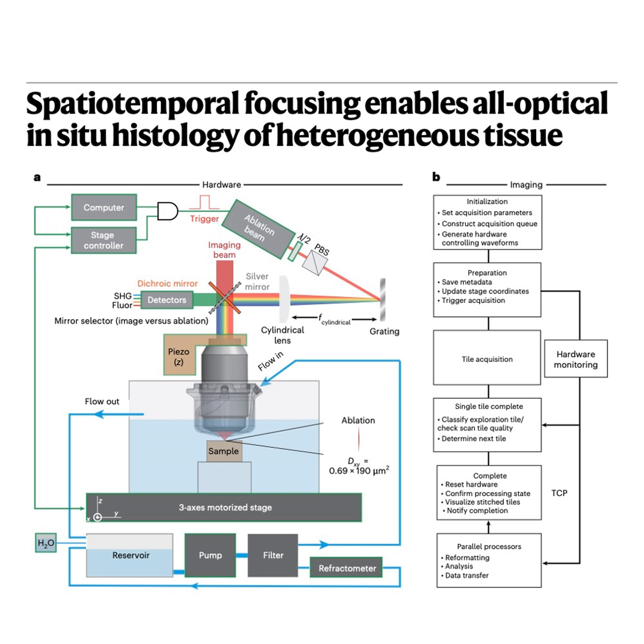Okay, so let's try to synthesize this. We've journeyed through a complex system that leverages some pretty specialized physics, spatiotemporal focusing, to turn a femtosecond laser into an efficient, line-shaped cutting tool. Combined with really sophisticated adaptive autonomous software control, the robot managing the fluidics, the imaging, the material-specific ablation, the path planning, the quality control.